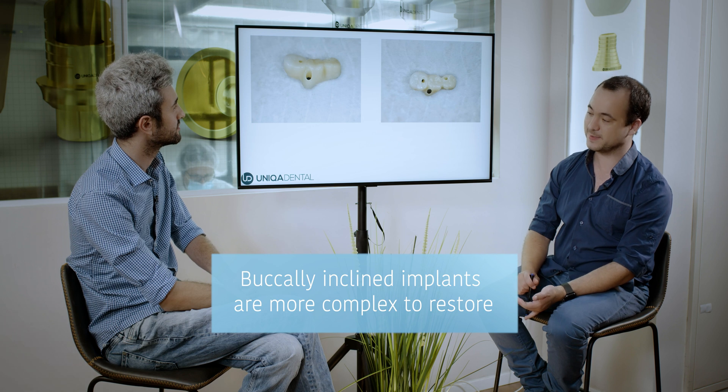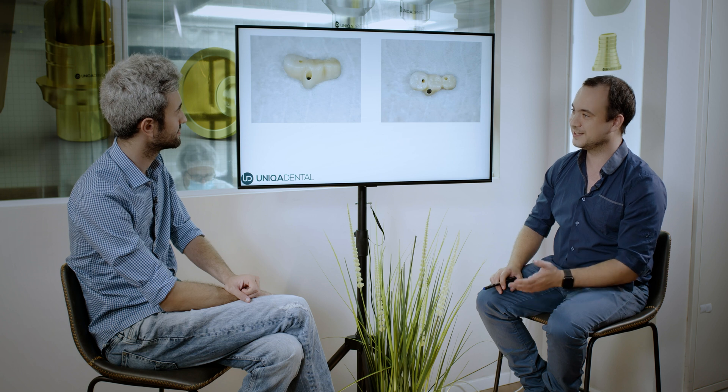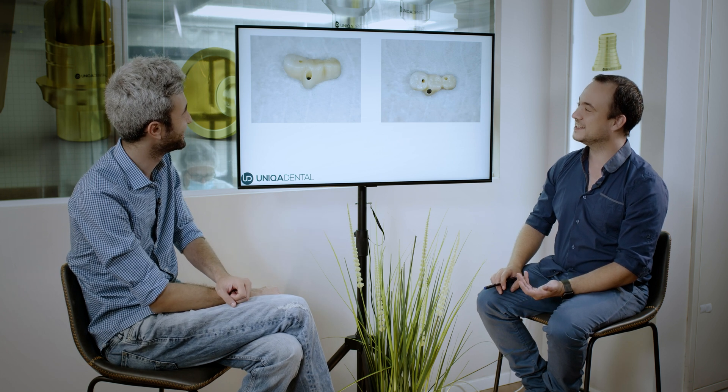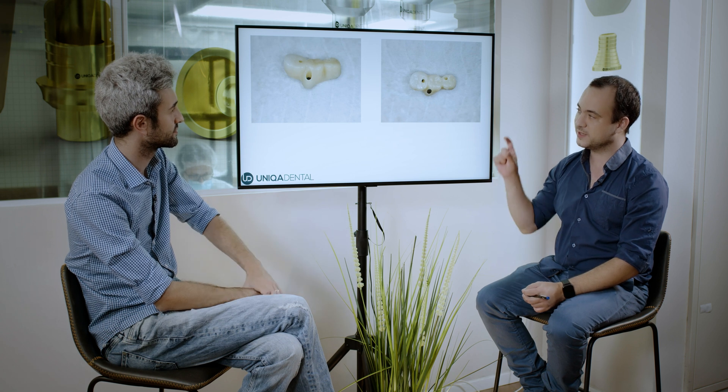If you want to make a cement restoration, you don't have space at all. The only option is to just leave this implant alone and not restore on it — restore only on those two. And if you want a cemented restoration, it's a problem because you want the smallest possible abutment and the smallest possible height of the abutment.